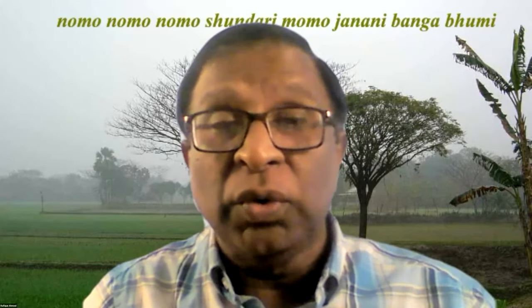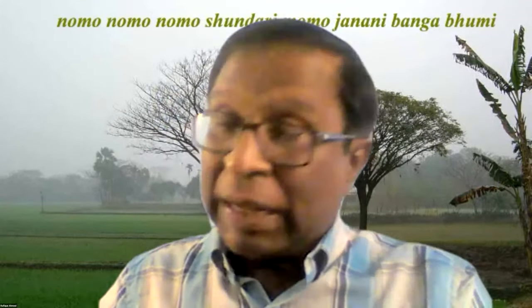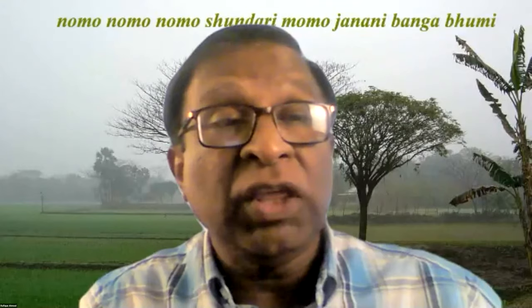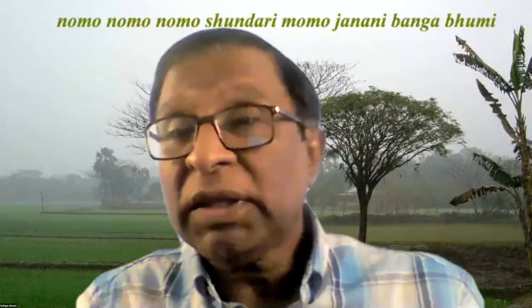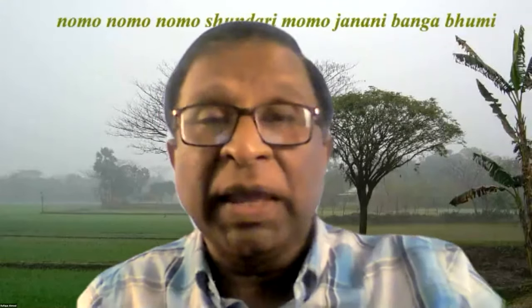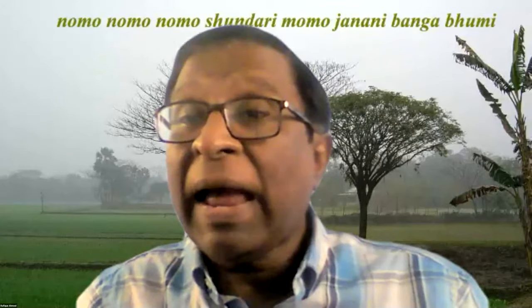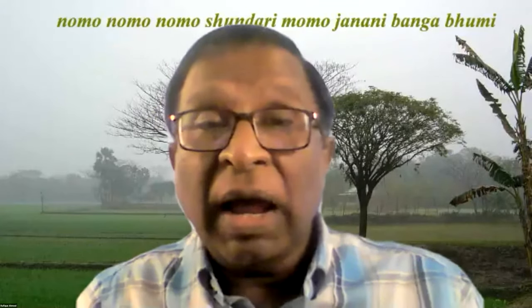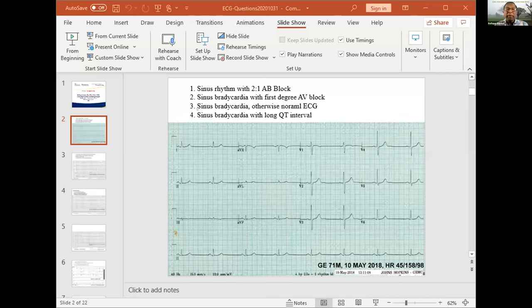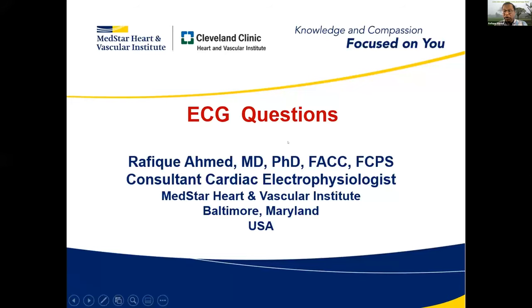Today, as we do, I have to mention something about computer interpretation that Nazrul Bhai mentioned. All our ECGs are read by the computer. Anytime I get an ECG, I do not look at the report. Because if I look at that report, it biases me. So please have that practice. When you have a computer-generated ECG, please do not look at that report. Have your own interpretation and then compare with the computer report, whether it's accurate or not.